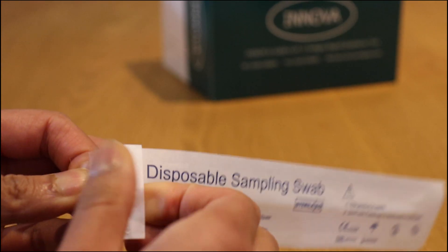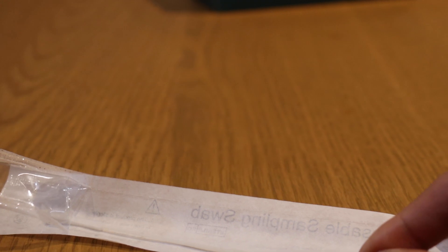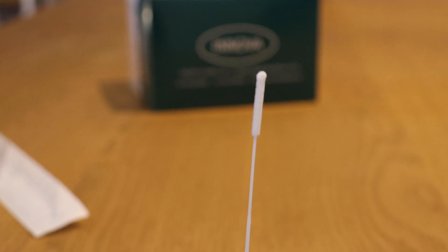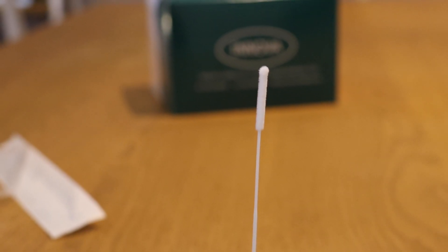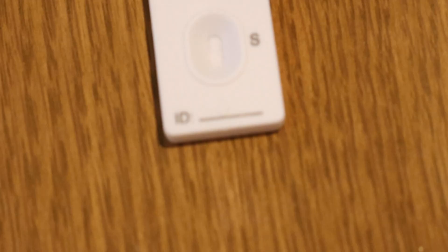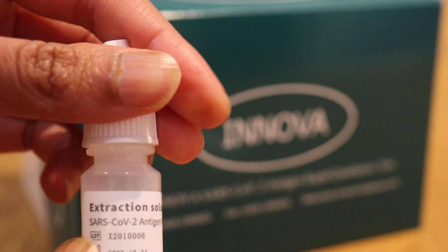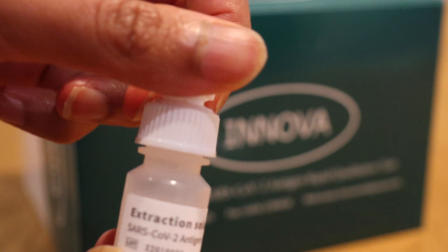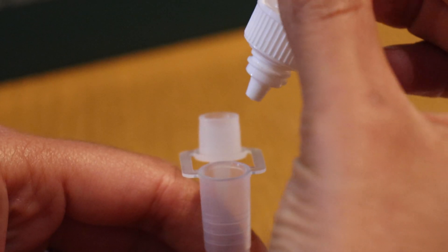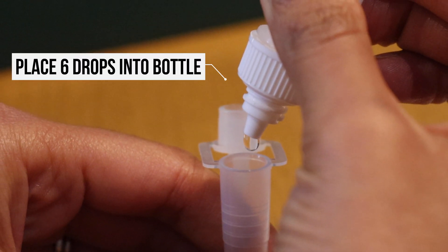Make sure you've washed your hands thoroughly for 20 seconds with warm water and soap. Take out the swab, making sure you don't touch the soft end of the tip. Get your other kit together — the extraction solution and the testing cartridge — and place them on a clean flat table. Take the lid off the extraction solution and put six drops into the little bottle, keeping it upright.